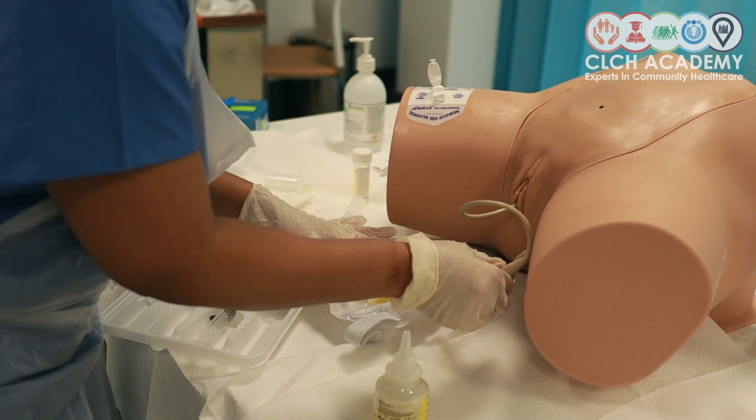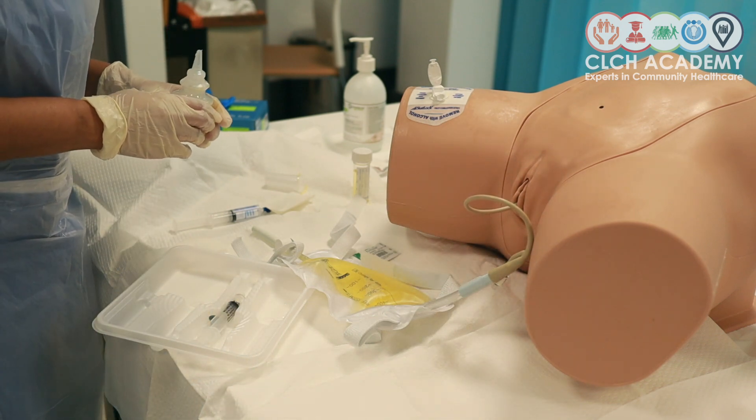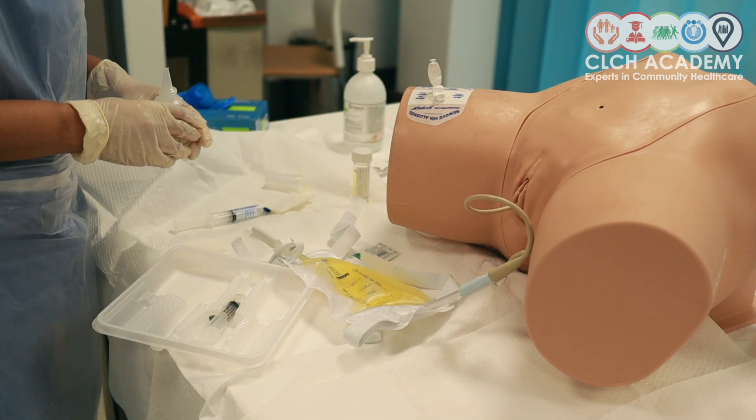That's how I would flush the catheter if I needed to give the patient a flush to clear any debris or sediment.